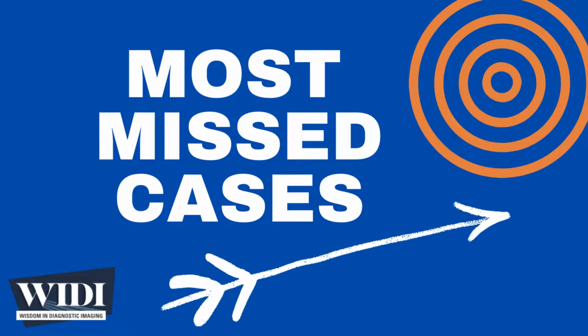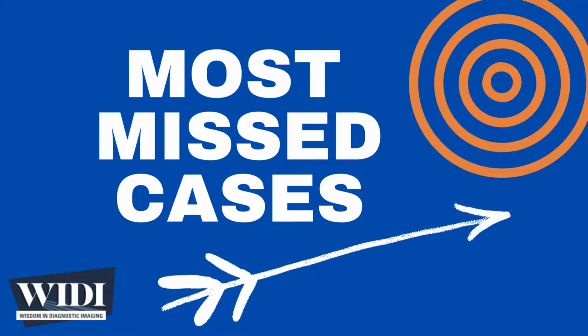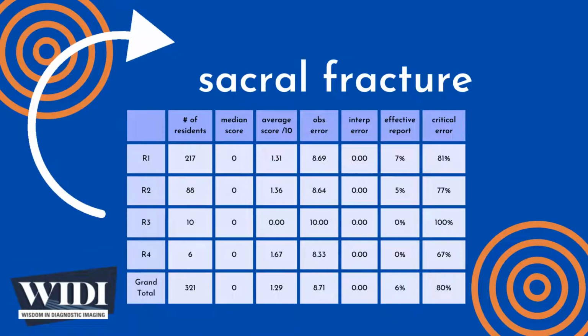Over the last 10 years, the Department of Radiology at the University of Florida College of Medicine has conducted a simulation-based evaluation of radiology resident competence in critical care imaging. 321 residents interpreted this case of sacral fracture as one of 65 cases during an 8-hour simulated on-call shift with a median score of 0 out of 10 and overall average score of 1.29 out of 10.